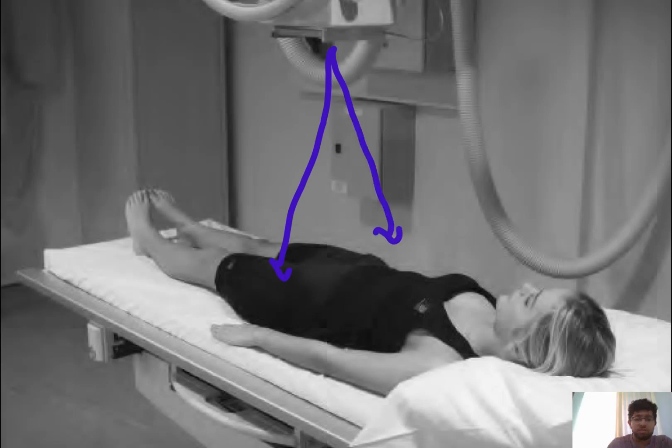So to compensate for this, we will do the internal rotation of the limbs such that the oblique rays are compensated by the internal rotation that we do. Normally when we do internal rotation, the lesser trochanter is not prominently seen, but not visible. But in the AP radiograph of the hip, because of the divergent rays, we can still see some part of the lesser trochanter. Along with the internal rotation, we keep both the hips slightly in abducted position, and this is how we position the patient.